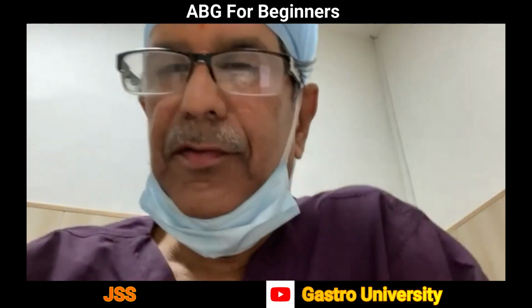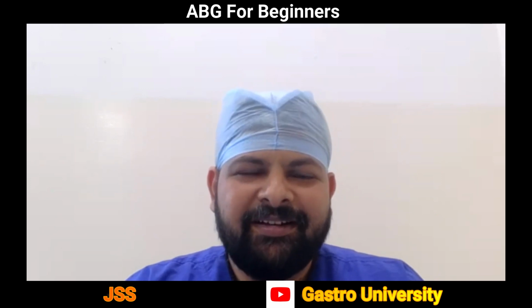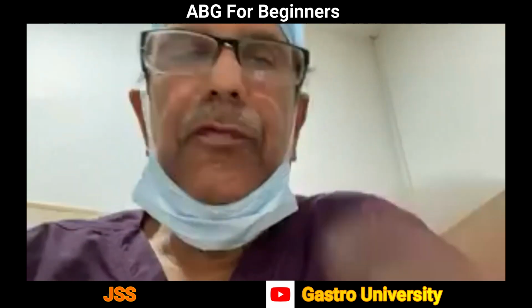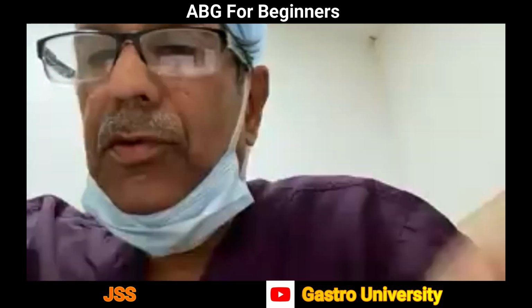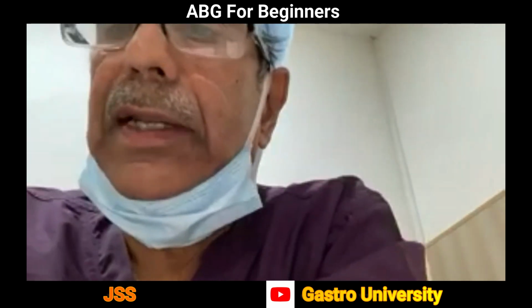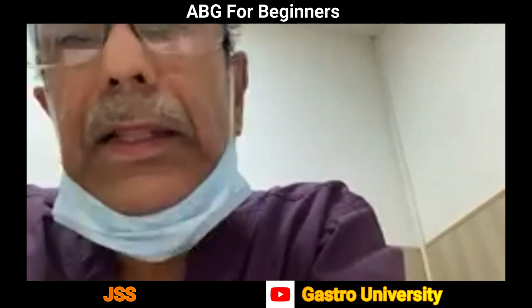That's right. I fully agree. ABG interpretation requires day-to-day practice. Whenever you are seeing an ABG, just go through it, and over a period of time, you will gain expertise. And that would be a take-home message. So all that is required is reading an ABG every day. Now, one point I would like to add here: when you see and interpret the ABG, you need to consider the serial ABGs, and you should interpret it in the background of the clinical scenario which you have been observing. So that's pretty important. The clinical course the patient has taken, and the serial ABGs.